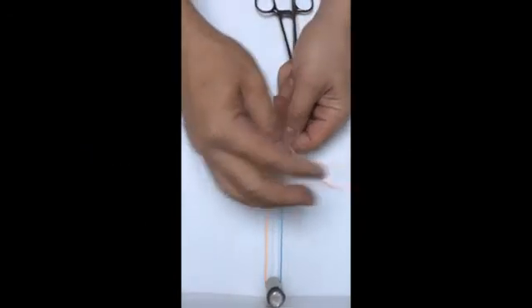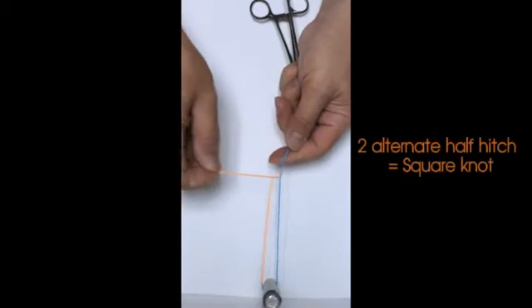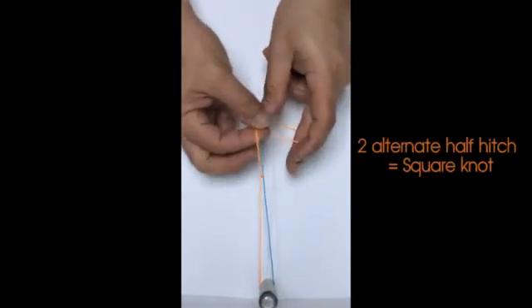In this demonstration, two alternate half-hitch knots equivalent to a square knot are used as a sliding knot.